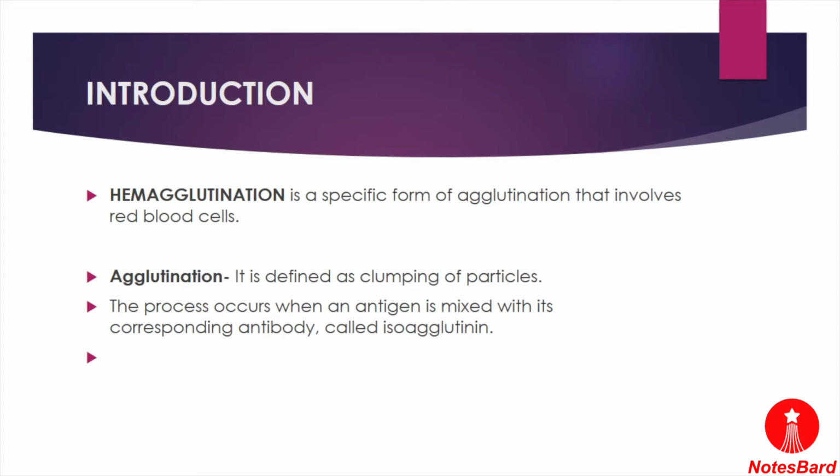Before moving to hemagglutination, let's first understand what agglutination is. Basically, the word agglutination means clumping of particles.